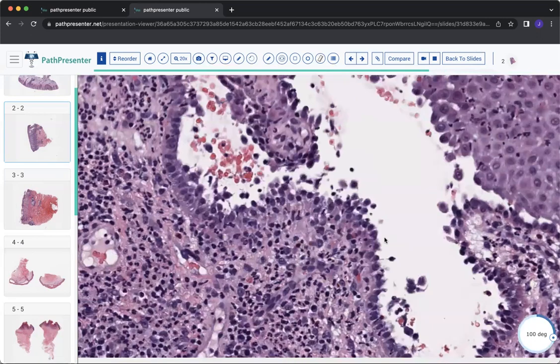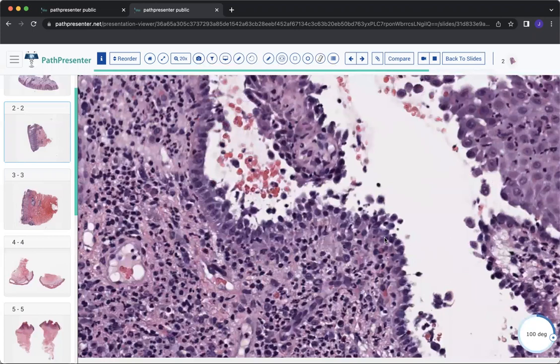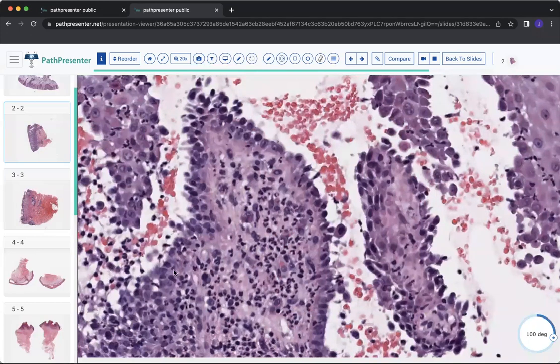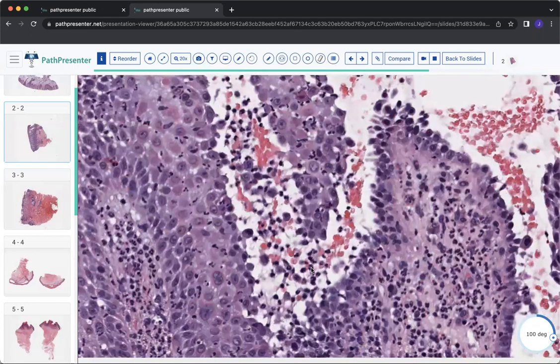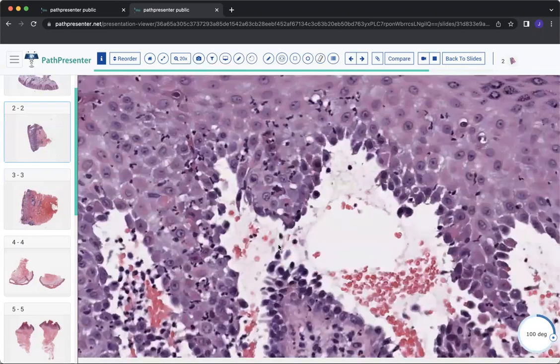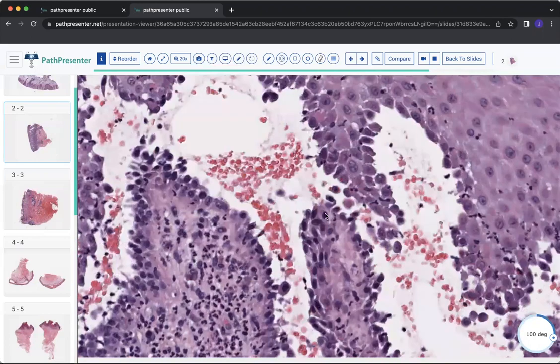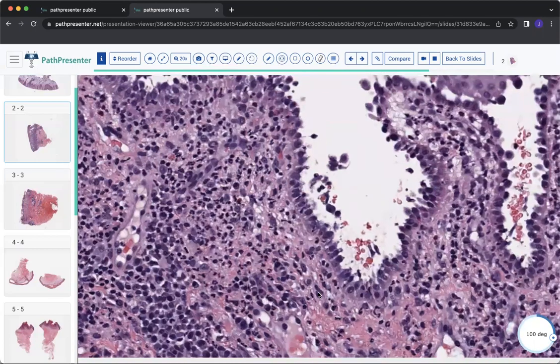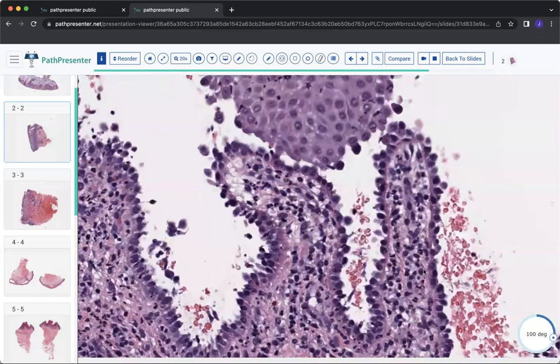That's the fascinating thing about cutaneous biology, is that we figured out a lot of the critical proteins that are important in each layer. And then when you have an autoantibody attacking one particular aspect of that architecture, then you actually will see in real life what's happening. And so it's just really nice to appreciate the link between the structural integrity proteins, autoimmune bullous disease itself and how it presents, and then seeing on derm path the evidence of that. So this is pemphigus vulgaris.